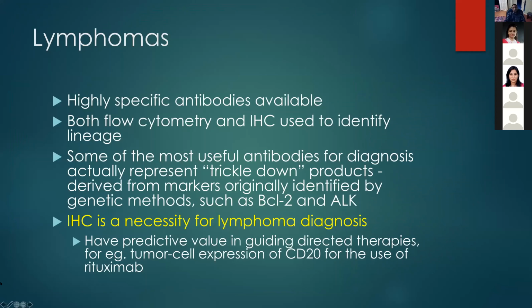One line I have put down in yellow to highlight it. I've highlighted that line because you cannot make a diagnosis of lymphoma. All you can say is this is a lymphoproliferative disease on your diagnosis line. That's all. And again, at my institution, somewhat from my own interest, we have done a lot of work on lymphomas in the oral cavity.